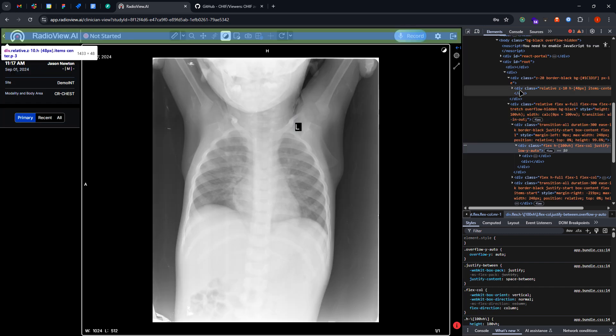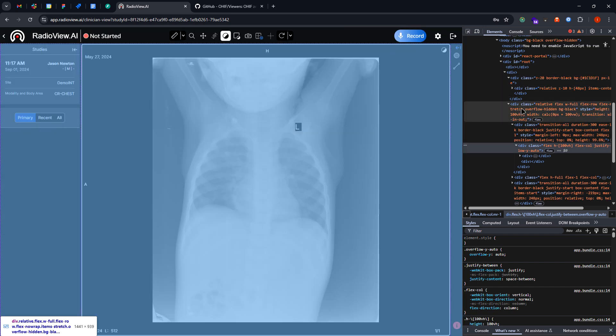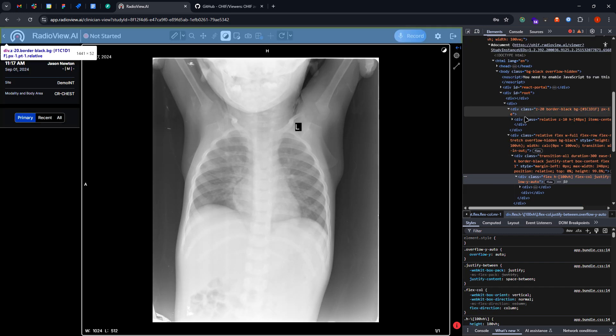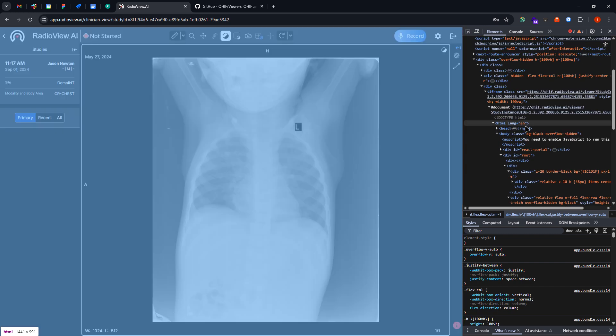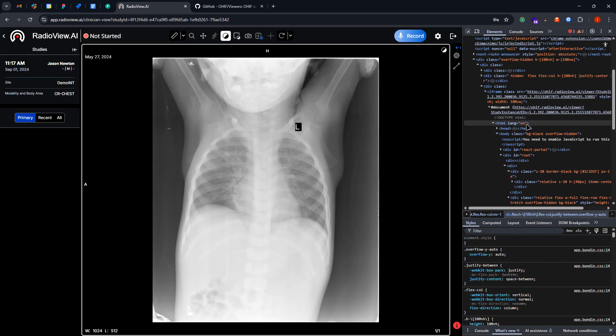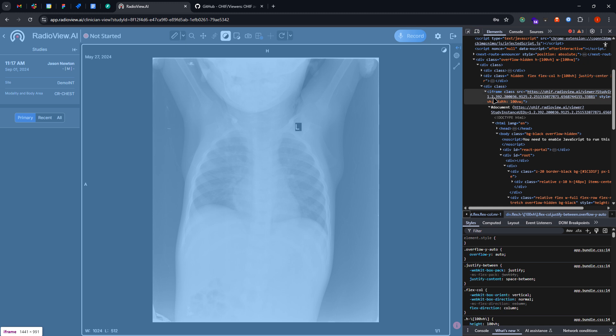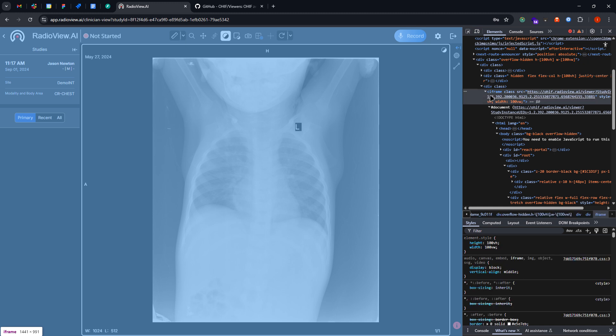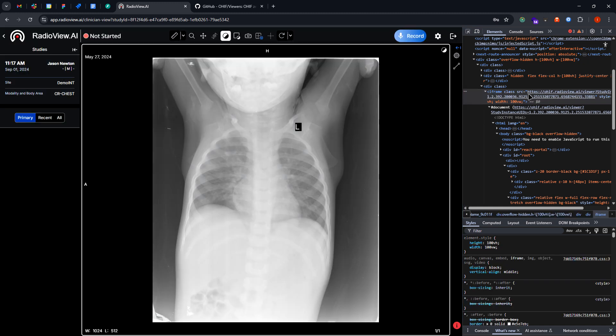Alright, so basically what we are doing here is we are using the OHIF in an iframe. You can see the iframe here.